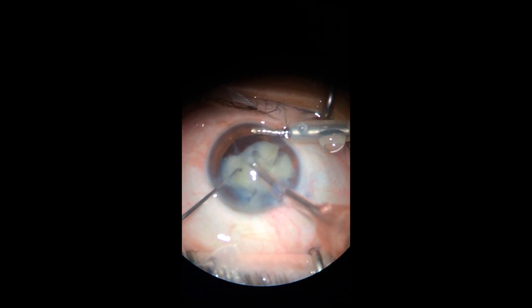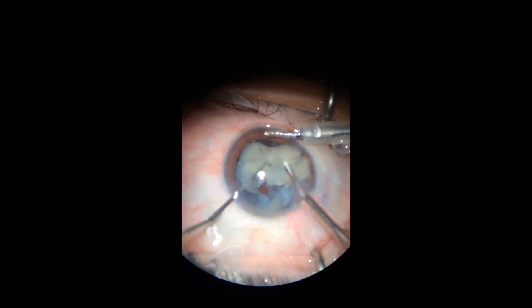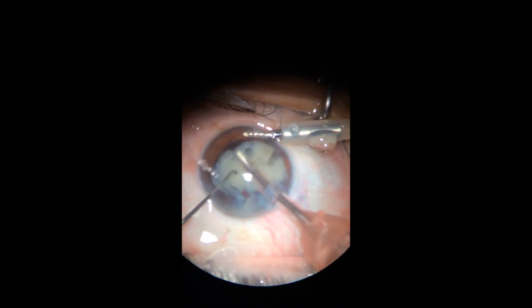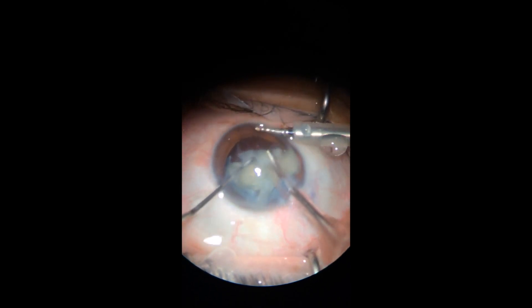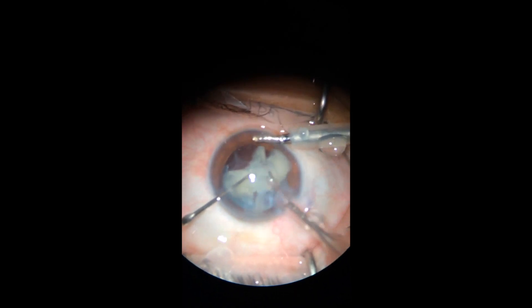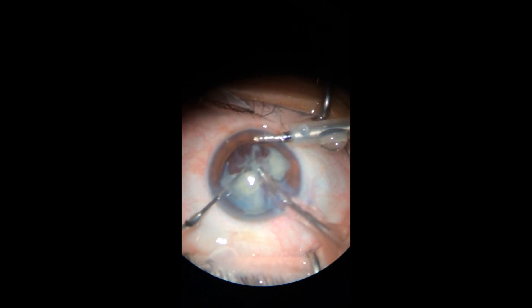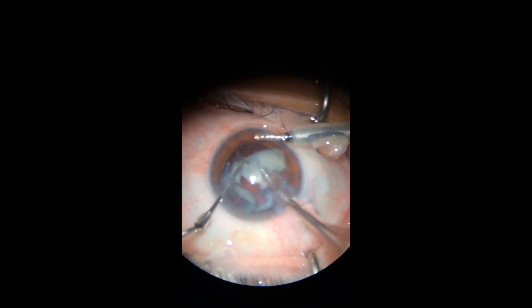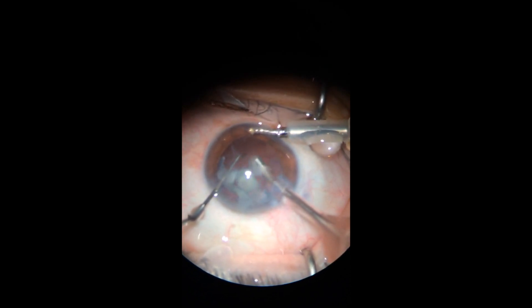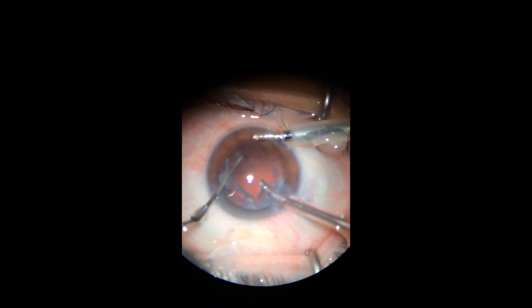Trying to take it out, it was very adherent — it involved the whole sac and anterior membrane. So I tried to push it and it came, but it was like coming with the whole sac, so I stopped doing the traction. You will see in a second what I'm talking about.